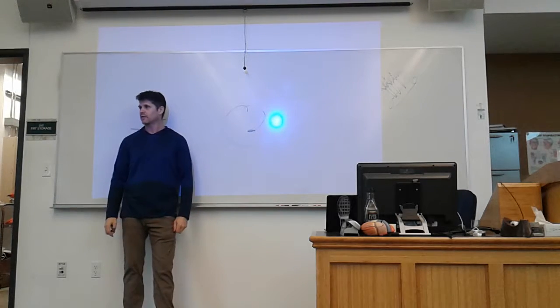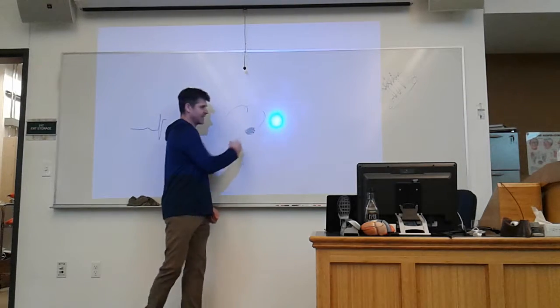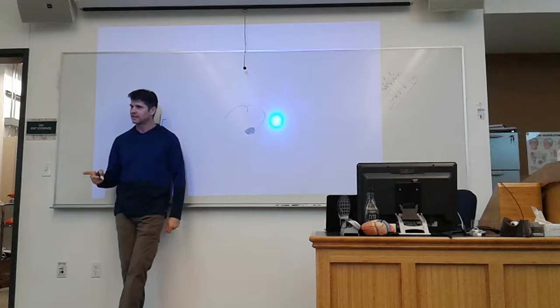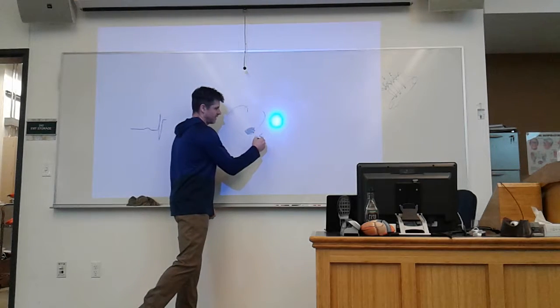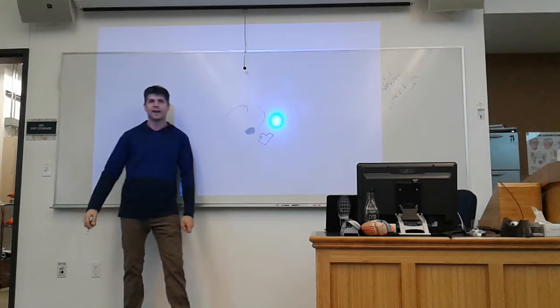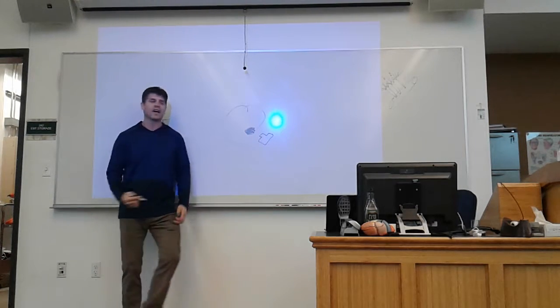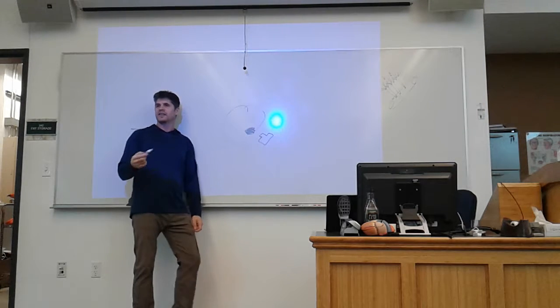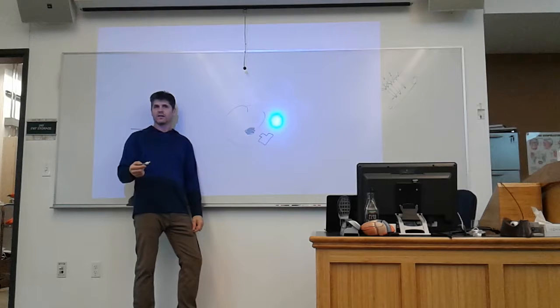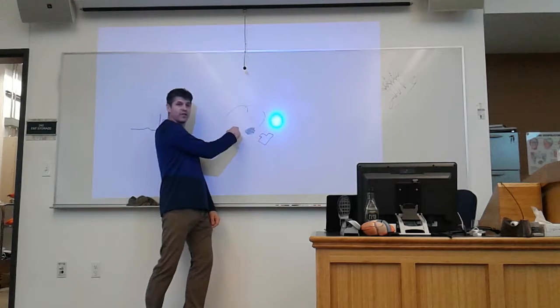Does that make sense? And because this stuff is all dead, electrically speaking, we have no electrical activity, then a camera that is hanging out right here, looking at that area, can't see anything electrically right there. Which means the next electrical thing it sees is what? Whatever's next over here.